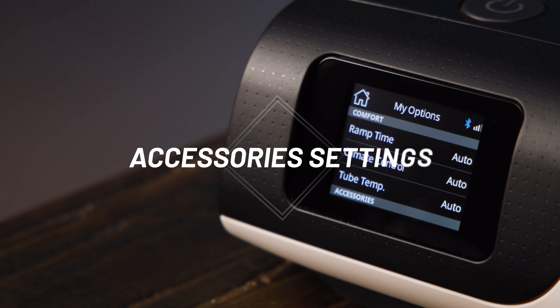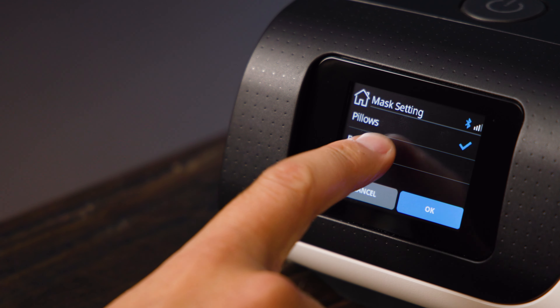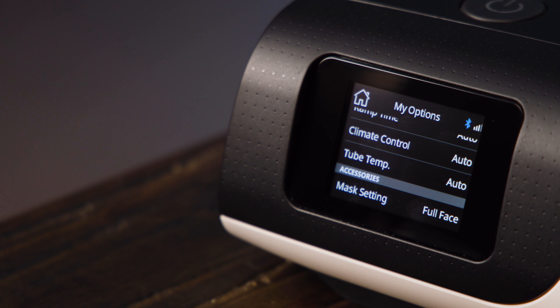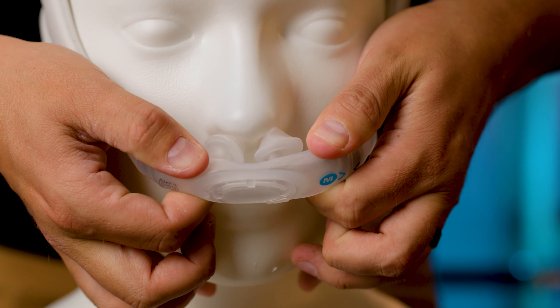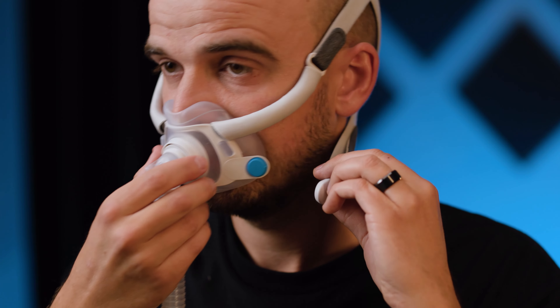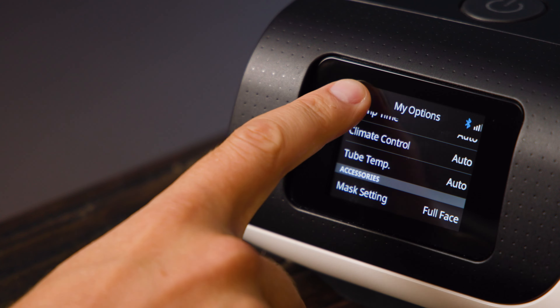Under accessories, you'll find mask settings. Make sure what is displayed matches your mask type, as this setting helps the therapy algorithm know the effects the pressure will be having at your mask — so it's important to get this right. There are three options, which match the three kinds of mask: pillow masks have protrusions that go into your nostrils, full face masks cover both your nose and mouth, while nasal masks cover just your nose but don't go into your nostrils. That's all the options, and to get back to the root menu, hit the home icon in the top left.